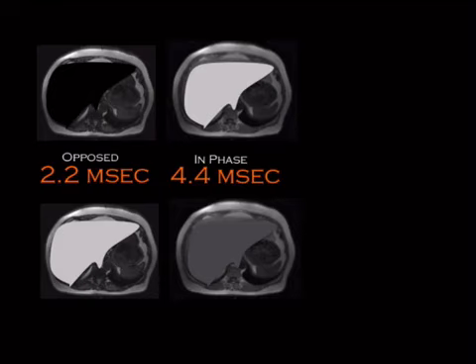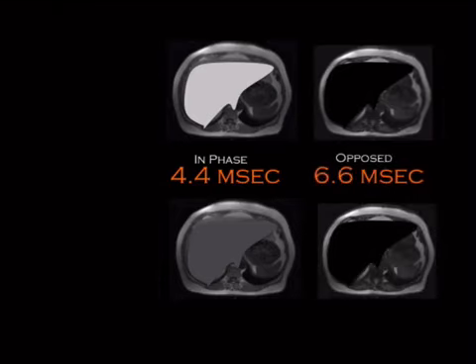But let's take a look at some trickery here. What if we waited? The tech was asleep, playing on Facebook, and didn't bother to image at 2, instead waited until 4 and was just like, it's okay, that opposed phase will come again at 6. I'll just pick it up then.